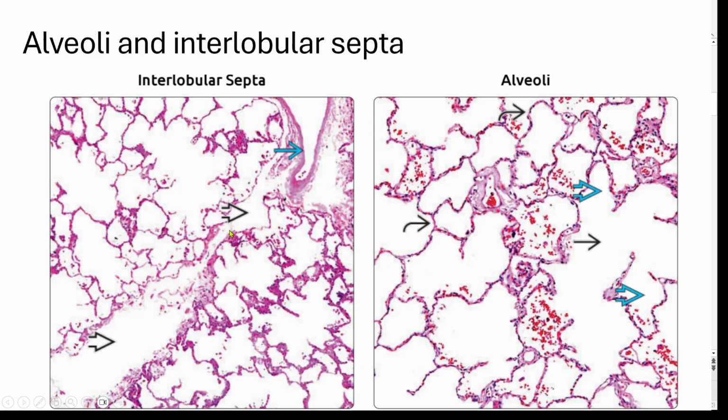The pulmonary vein has a loose connective tissue around it when it's in the interlobular septa. So the interlobular septa are composed of very loose connective tissue as well as the pulmonary veins, separating segments of parenchyma, parenchymal units, whatever you want to call them. I think they're called bronchopulmonary units, segments.